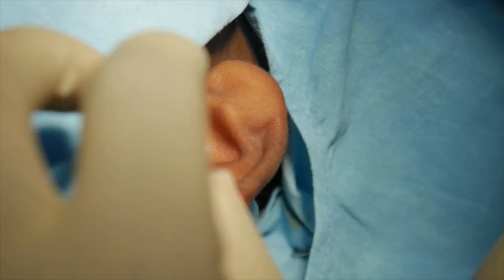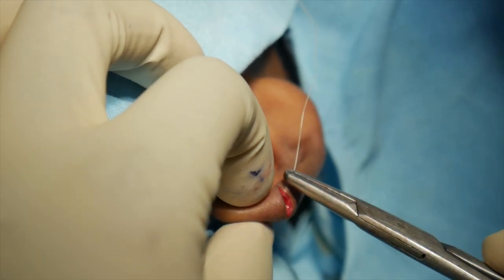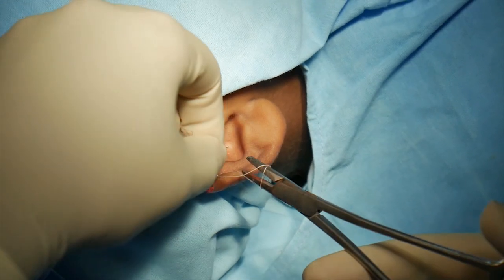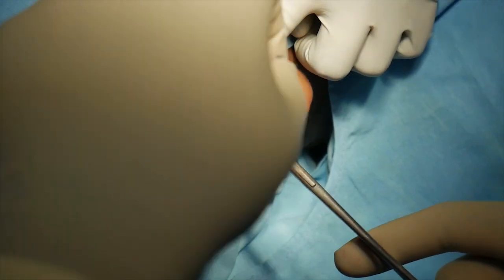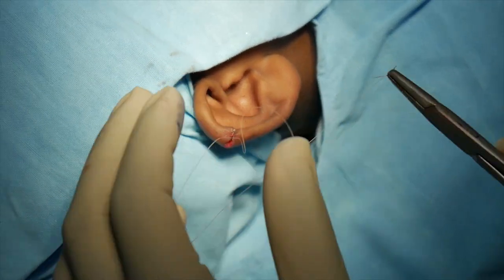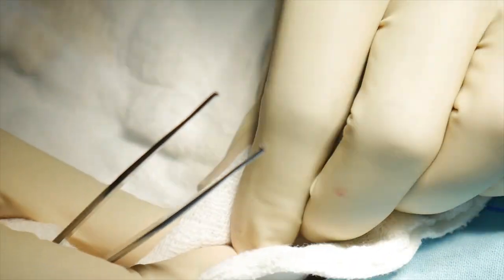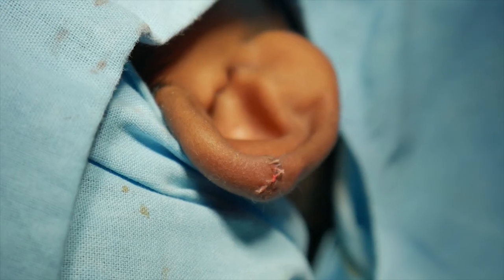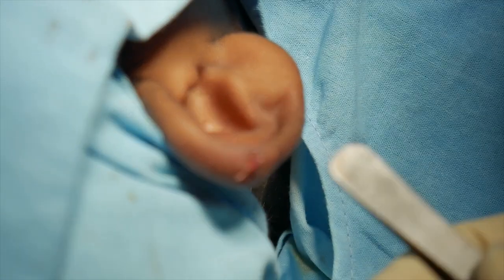I think this should be enough. I think this is a nice contour. It's not going to be visible in a few days time.